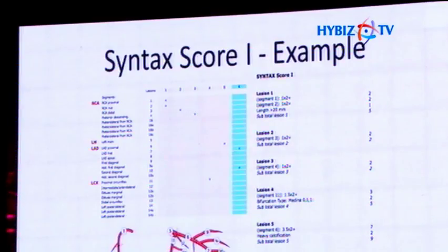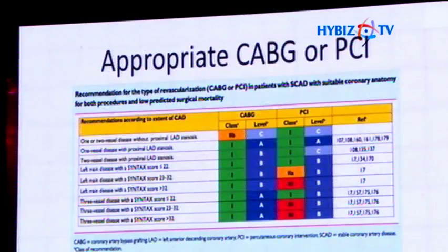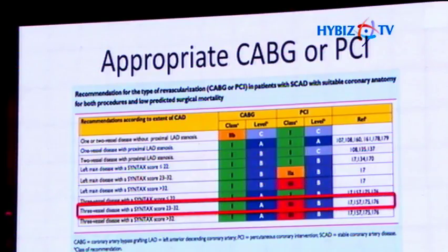Well, is angiography enough? I just showed you a second ago that angiography and FFR have a huge discordance, and when we actually use the physiology information, we define the disease much better and identify the right lesion to treat. So we should be adding physiological information. When we look at the appropriate use criteria, for a patient with a SYNTAX score of 32, the PCI indication is class 3.